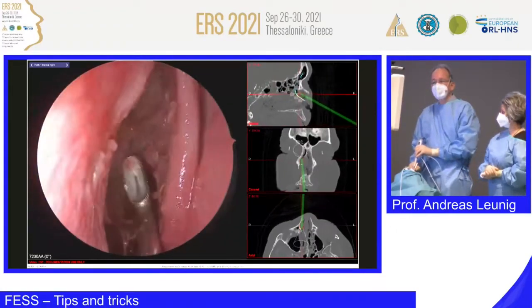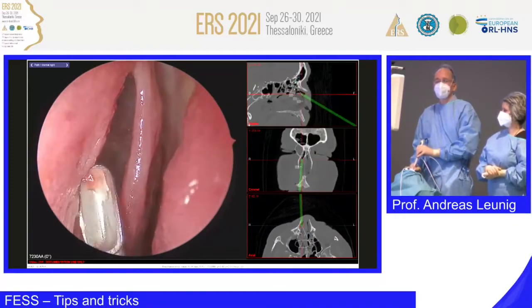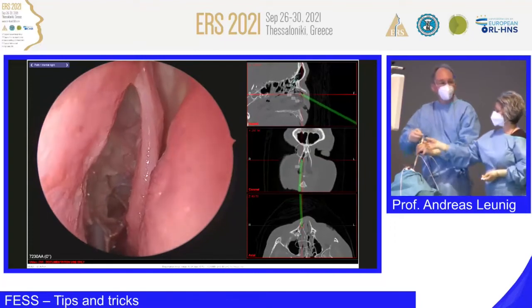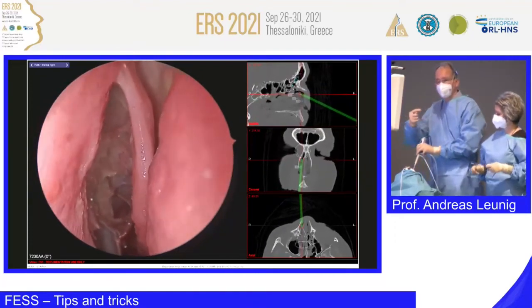Okay, so now I'm showing you maybe how we could, from the principle here, do a type 2A, type 2B opening of the frontal sinus.